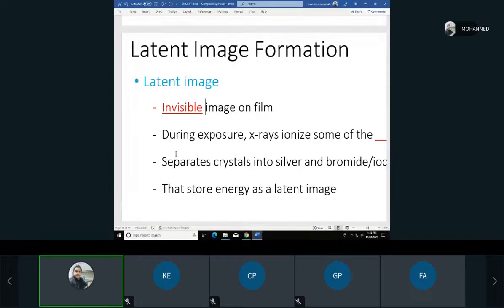You take an X-ray and it shows on the computer right away, right? But in film, we used to expose the X-ray, then take that X-ray and put it in processing solutions to be able to see the actual X-ray, just like the photographs before, right?